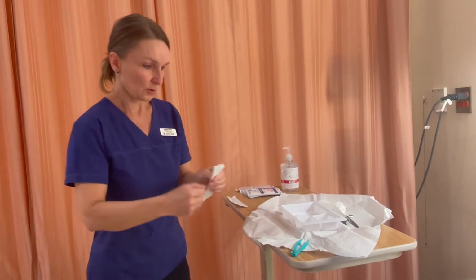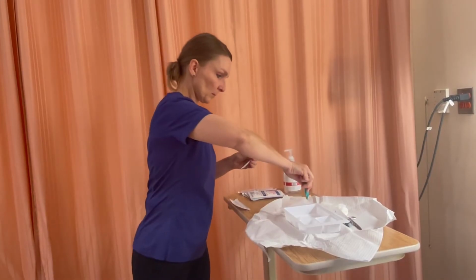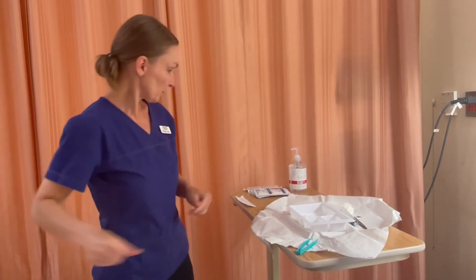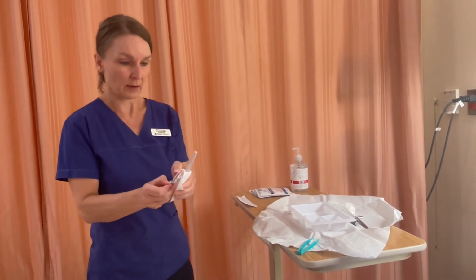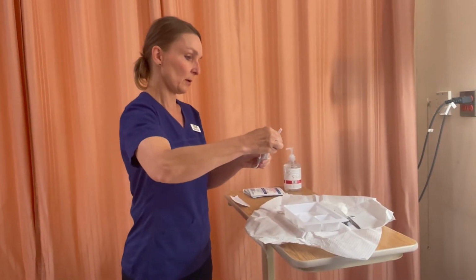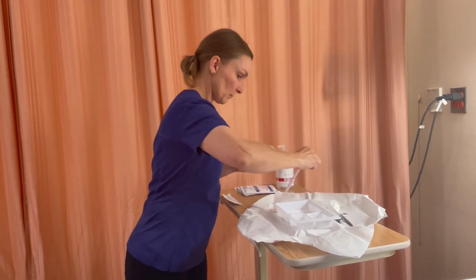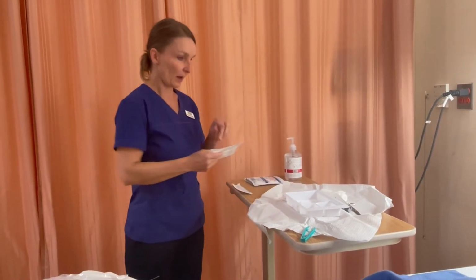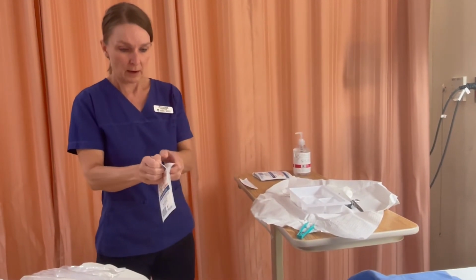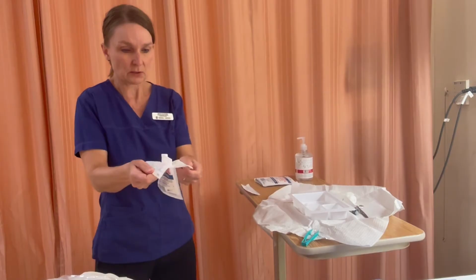And I'm going to add some extras just in case I need an extra couple. Cotton tip swabs here. I need my 20 gauge IV for irrigation. Because we have so many supplies, you kind of have to use several areas on your tray. At the end of the wound care, I will be putting these on top.